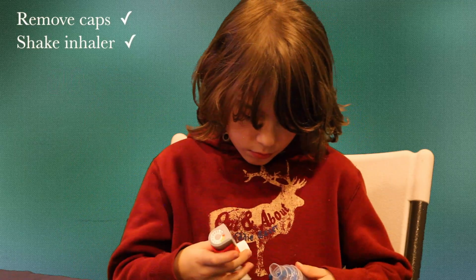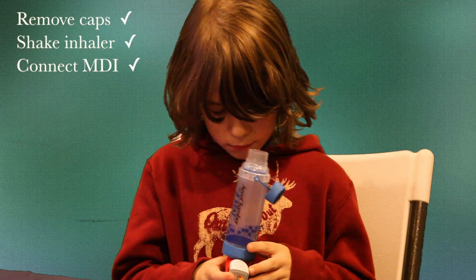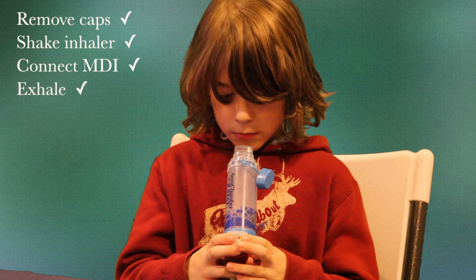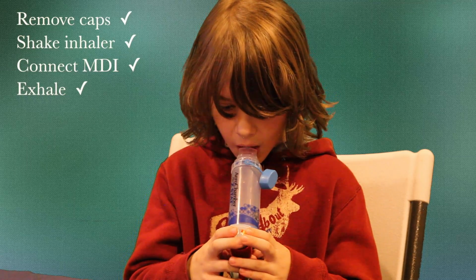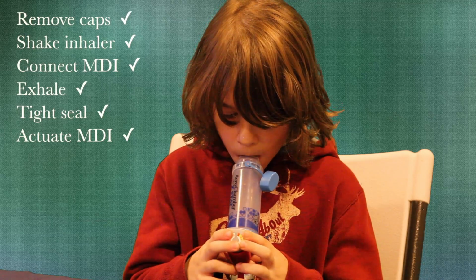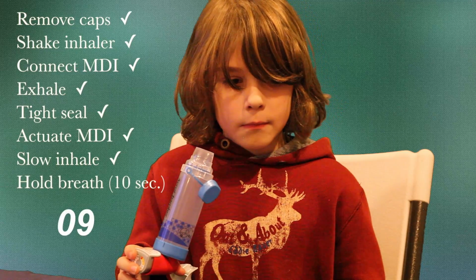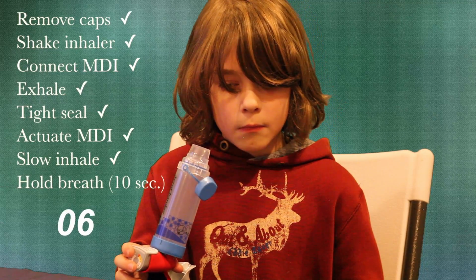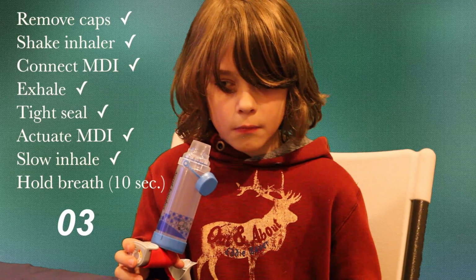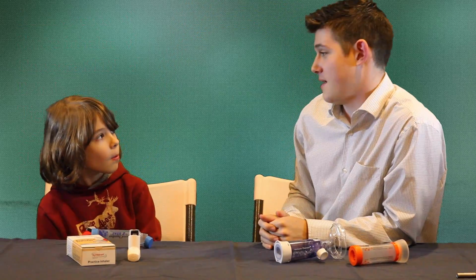Awesome. Awesome job, X. You've earned a high five and a sticker when you're on your way out of here. That's it. That's the whole procedure.